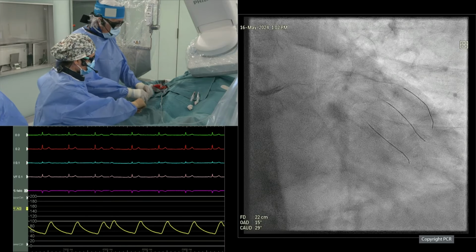So let's have a look at the effect of orbital atherectomy and of course balloon angioplasty now. We also have performed predilation, but we want to see if we have prepared the plaque properly. Good. So Nieves, you want to guide us on what you are doing? Let's make now a pullback. So first thing we need to check if we are engaged very properly, important, with the catheter. It looks like we are. We have adjusted our contrast, it is 415, and now the system is going to calibrate, and we are going to acquire angio at the same time to have co-registration.